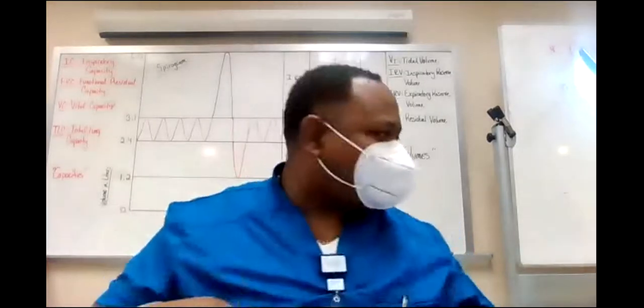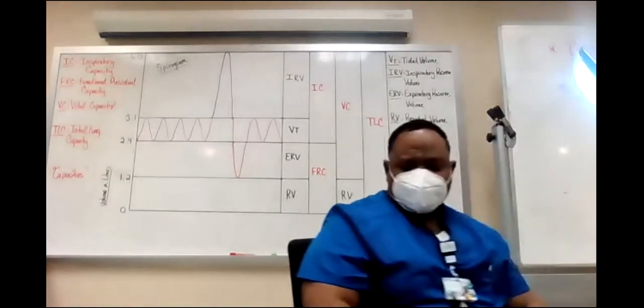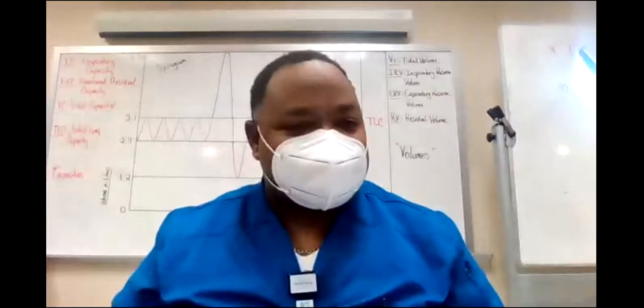You just breathe in it, and it has, matter of fact, I think I got one. When we do a pulmonary function study, that's got all kinds of stuff. If you put Wright's respirometer, that's fine. But that bio, whatever she was saying, are you saying body plethysmograph? I think so. Plethysmograph, now I would take that. A plethysmograph, that's a body box where they actually get inside this closed glass box, and they put a mouthpiece in. It can measure all of it. The body box can measure everything.